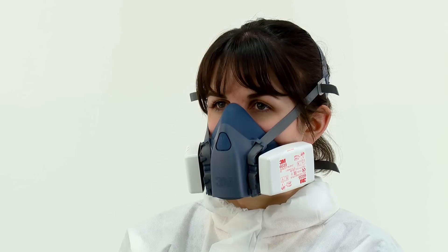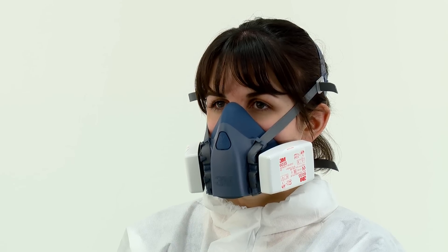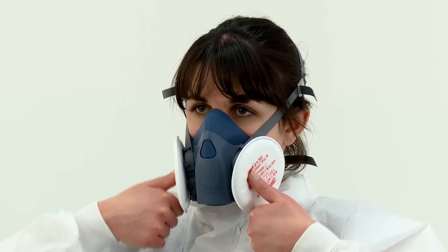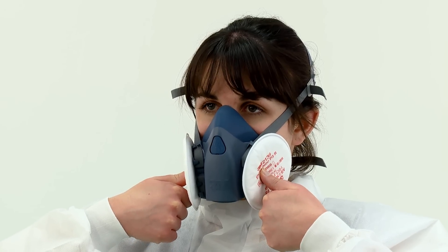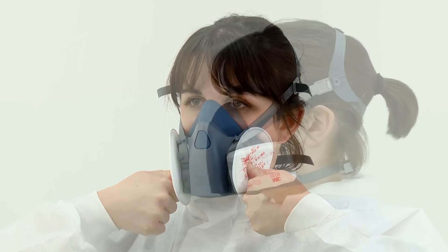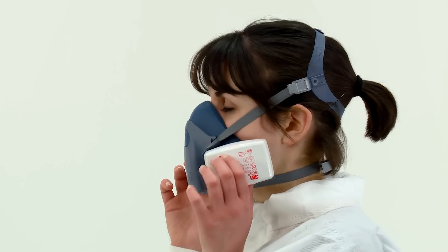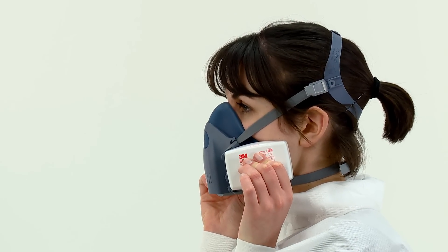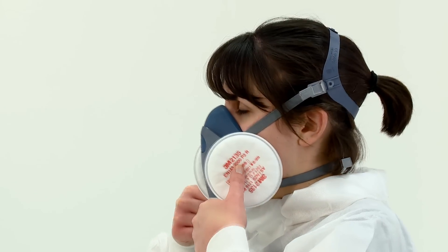For 6035 or 6038 particulate filters, press the filter cover and filter body together between your thumb and fingers. Take special care to squeeze the filter in the middle. For 2000 series particulate filters, press your thumbs into the central indentation of the filters. In both instances, this seals the filter and restricts airflow. Whilst continuing to seal the filters, inhale gently and hold your breath for 5 to 10 seconds. You should feel the face piece collapse slightly.